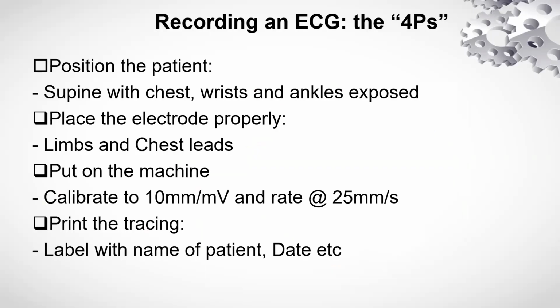All right, so recording an ECG, remember the 4Ps. Most of the times we're not involved in recording ECG, we just read it, but practically in the ICU, we've had to record ECGs ourselves. So that's why I decided to put this here, in case you find yourself trying to record an ECG for a patient. So remember the 4Ps.